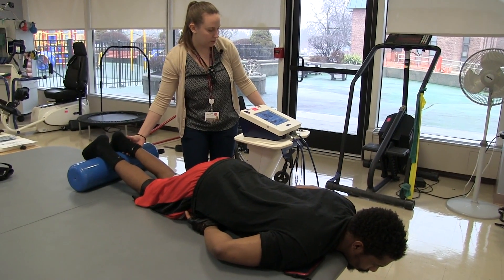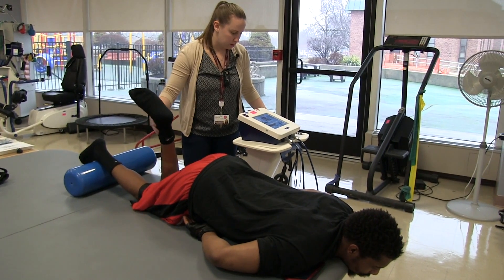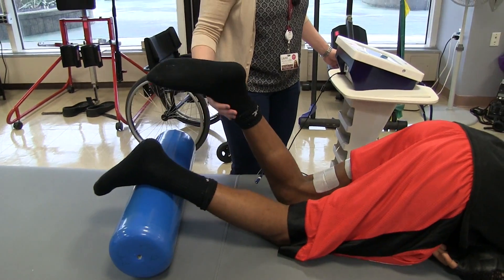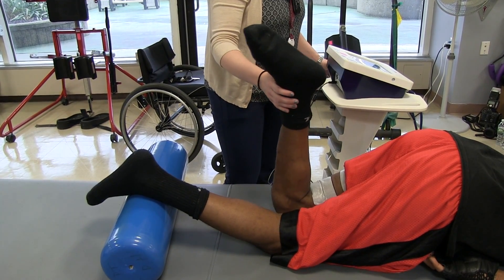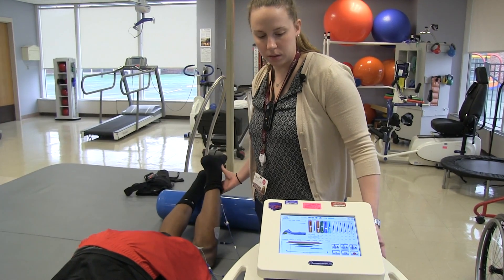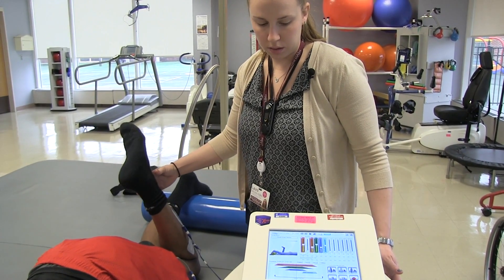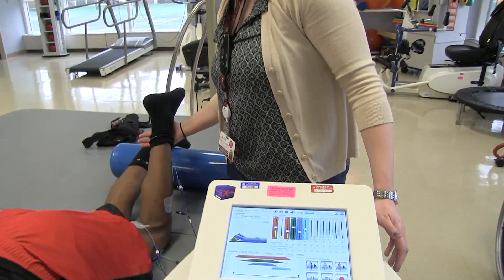You can't really hear the ding — up, I'll be the ding. Good. And down. Curl up. And down. You've got three more, okay? Up. Good. All the way up. Good. Control going down. Control, control, control. Very good.